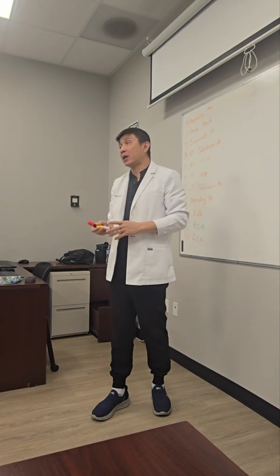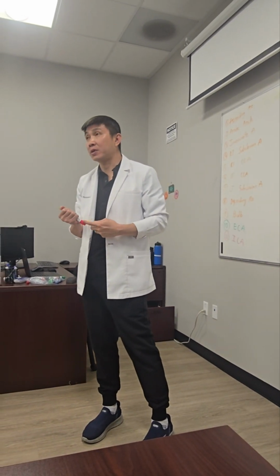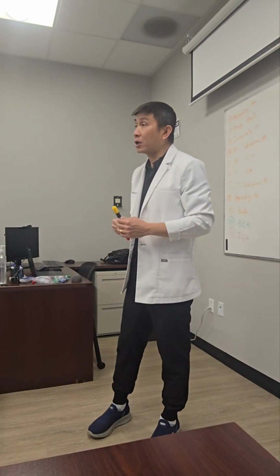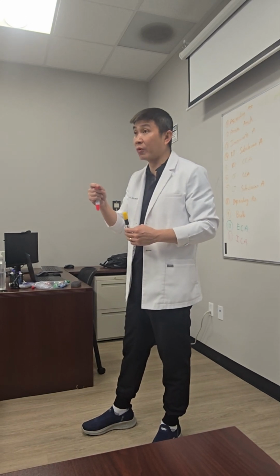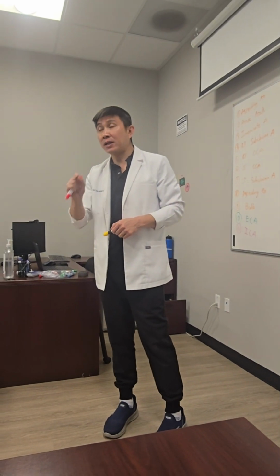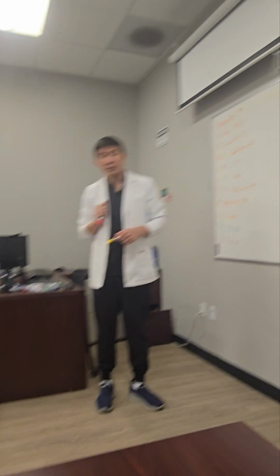a part of the carotid protocol is a syndrome we call triple S, subclavian steal syndrome. In that syndrome, the blood flow of the vertebral is going to go the opposite way from the CCA. Okay, so take a note: the vertebral artery and CCA always run in the same direction in normal condition.